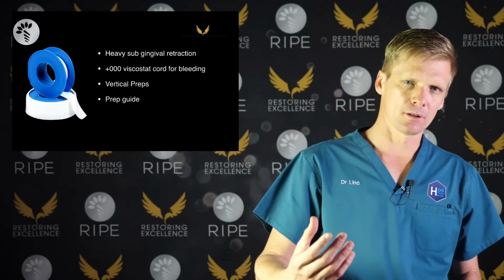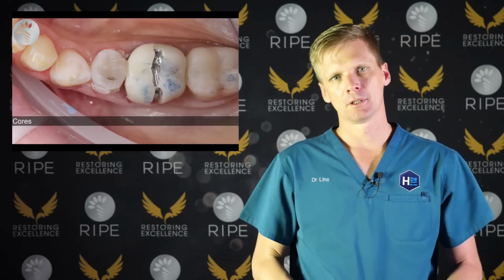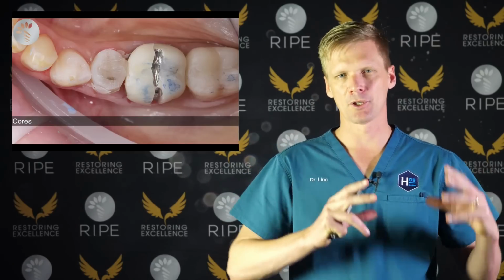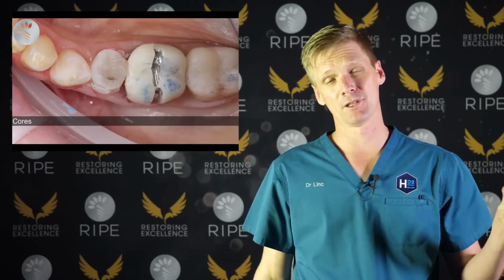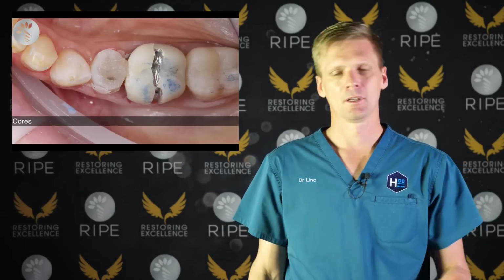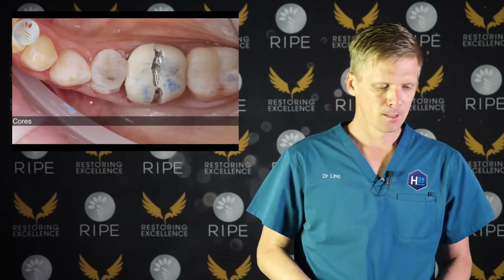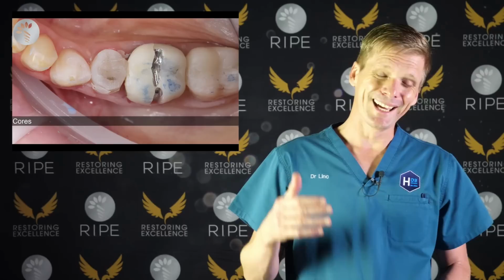So that's retraction and tissue control, and then kind of the scheduling side of things. They're probably some of the most important. The scheduling is super important, because if you don't give yourself enough time, you'll just panic, and then you'll cut all the corners, and then you'll have a dreadful time. Cores are actually really important.